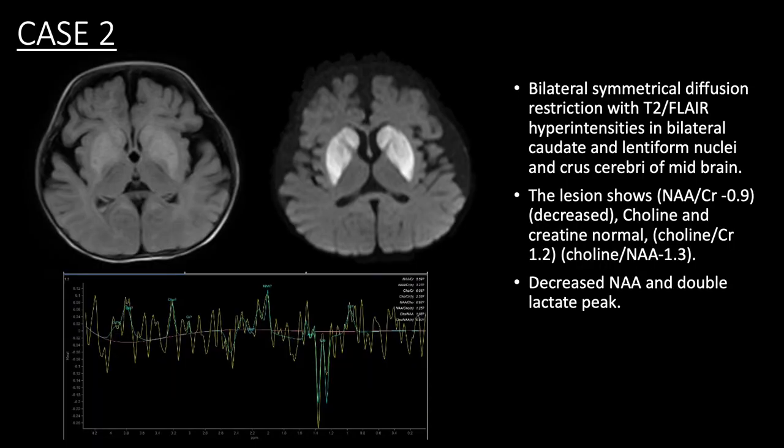Case 2 is of a 6-month-old patient in which MRI shows bilateral symmetrical T2 FLAIR hyperintensities in bilateral caudate lentiform nucleus, which also shows diffusion restriction. MRS shows reduced NAA and double lactate peak.